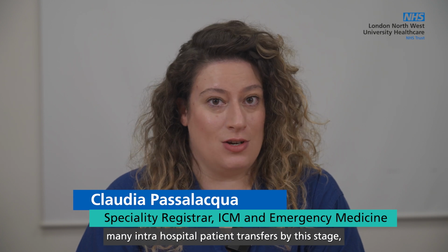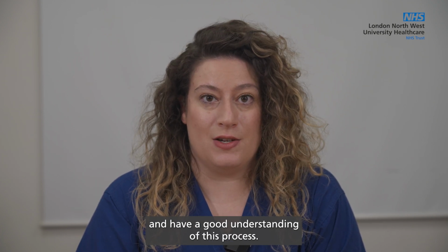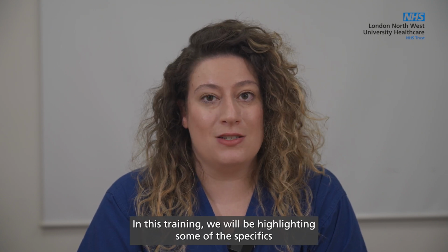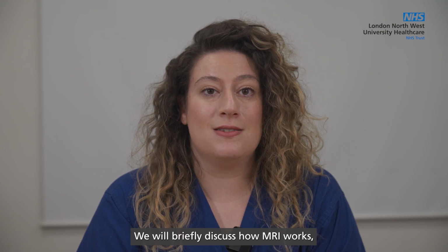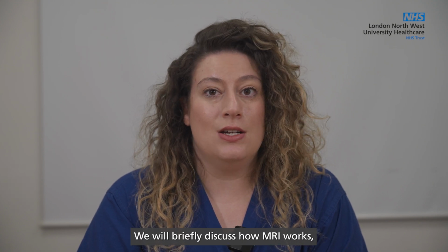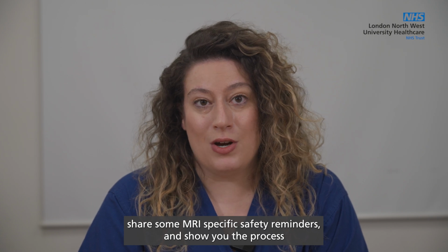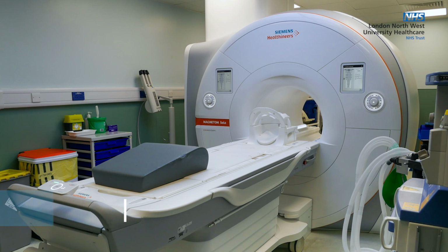We recognize you may have probably done many intra-hospital patient transfers by this stage and have a good understanding of this process. In this training, we will be highlighting some of the specifics related to MRI transfers within our trust. We will briefly discuss how MRI works, share some MRI-specific safety reminders, and show you the process of doing a GA MRI scan for an ICU patient.